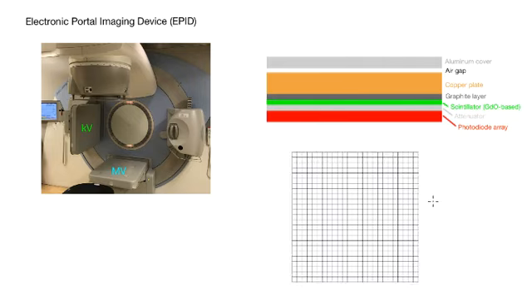So in the end, you have this map. You have pixels, we call them. The image is broken up into pixels. So you might have n by m pixels. And there are many, many pixels, usually millions. For example, you might have an image that's 1024 by 1024. Now, these pixels are going to affect the resolution of the image.